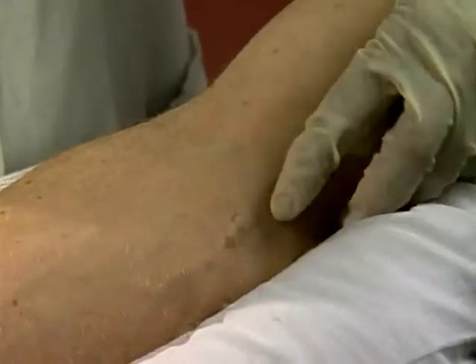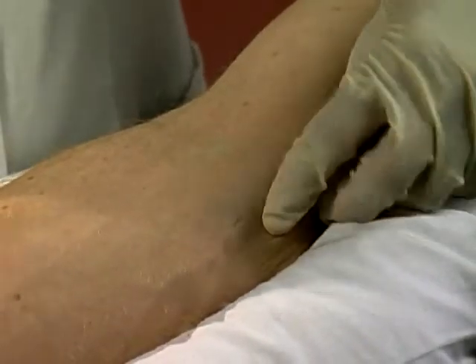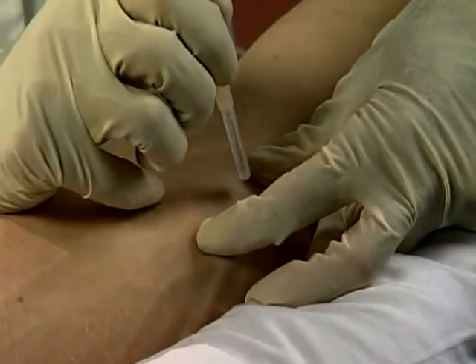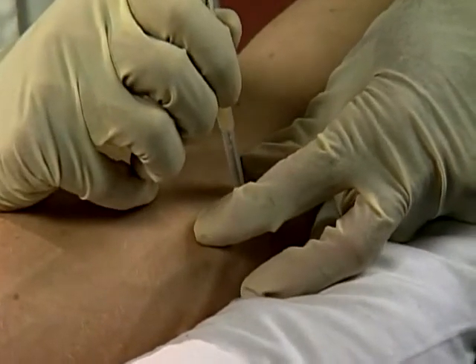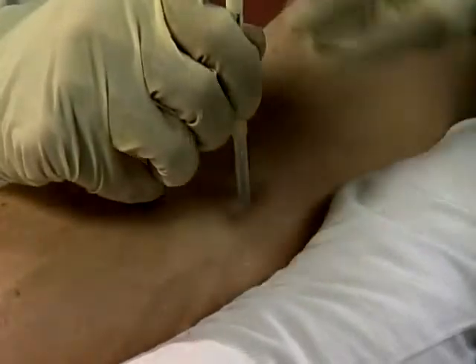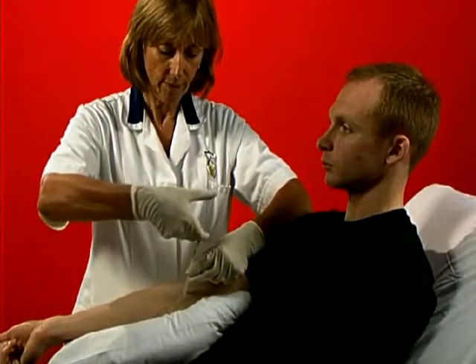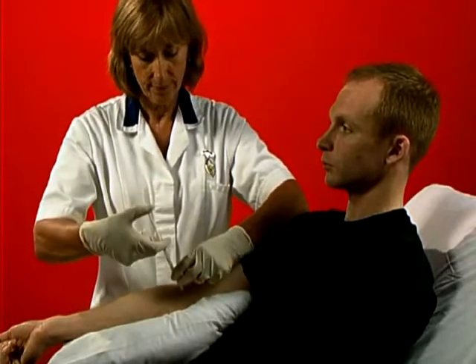Identify the medial epicondyle and the facet lying immediately in front of it. Mark entry point here, clean and firmly stretch skin, and rapidly insert needle perpendicularly. Pass slowly downwards to gently touch the facet. Aspirate and pepper into the enthesis.